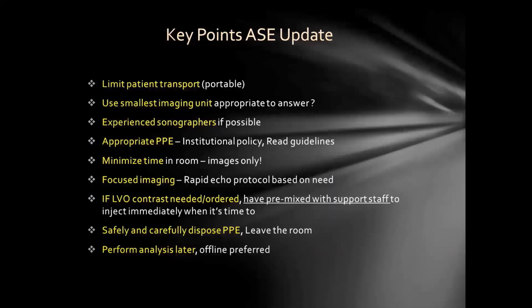If you have smaller imaging units than the large echocardiography carts, and you can obtain the information that is needed, and that's all you really need to get at this point, as sick as these patients are and the treatments that they're already using, they recommend that. Any of these smaller systems that can give you the information you need are obviously easier to bring in, image the patient, and clean after being next to a COVID-19 positive patient. So it's a very good suggestion.